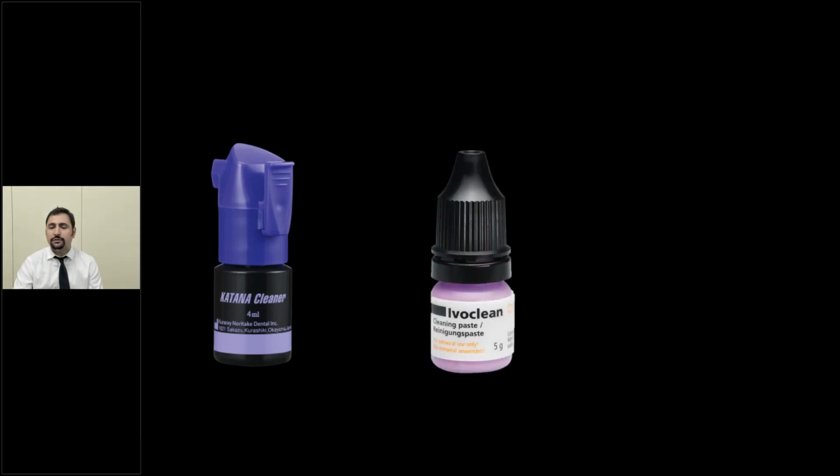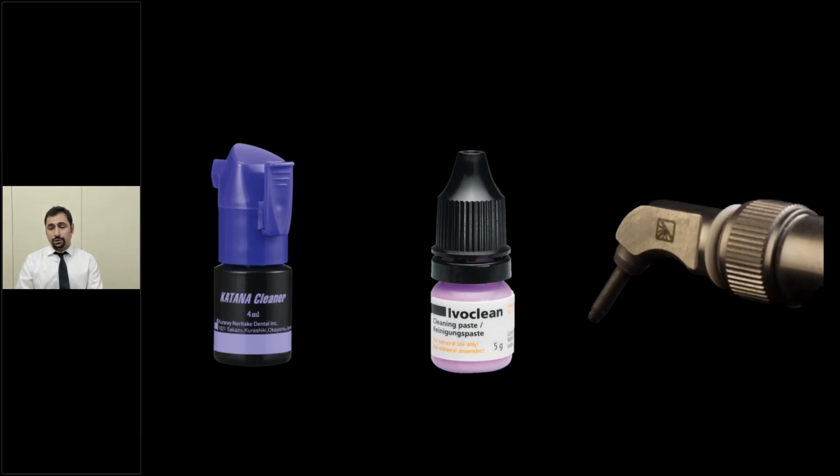We have one from Katana, it's a Katana cleaner. We have IvoClean, and again, we have the other choice of using air abrasion. I personally prefer that because that's fast, that's easy. I create again surface roughness, I increase the surface energy again, I bump it up.